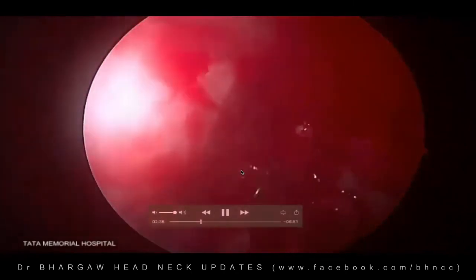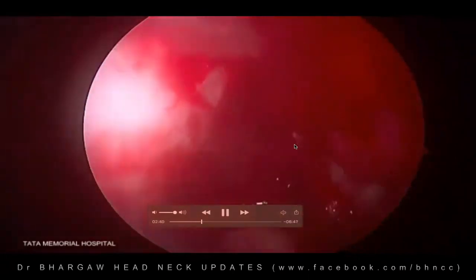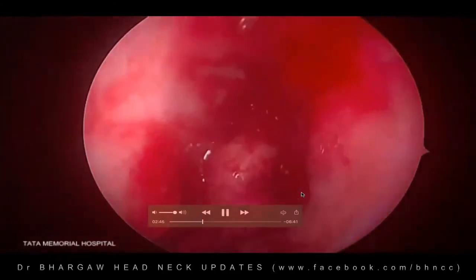So here, we raised the Hadad flap posteriorly from the anterior wall of the sphenoid, and then we put this Hadad flap into the nasopharyngeal area, away from your area of resection.